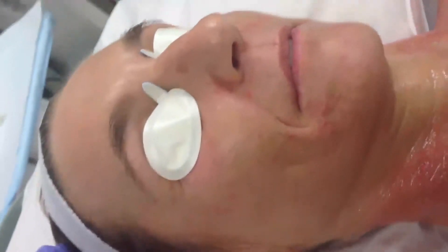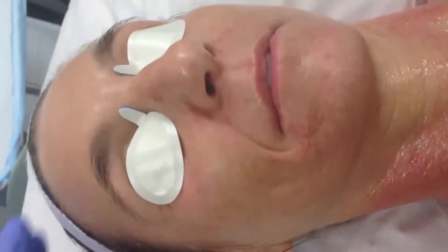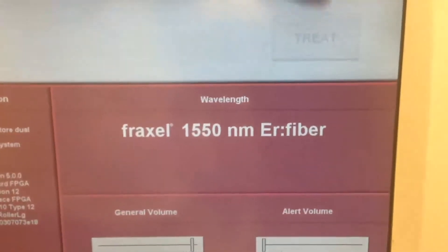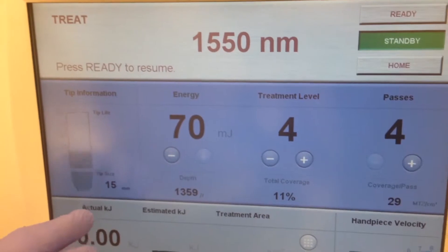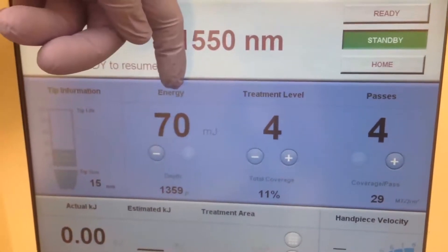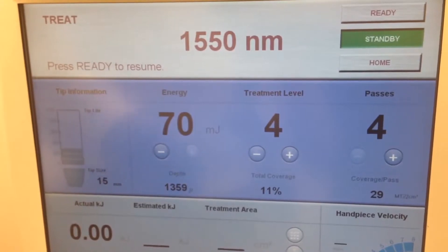This is our second treatment of this patient who has some photo damage and some acne scarring. We're going to be using the Fraxel 1550 and 1927. We start with the 1550 — this happens to be the Fraxel Restore, but you could use a variety of other devices as well. We're going to be using 70 millijoules, 11% density, four passes, and we're ready to go.